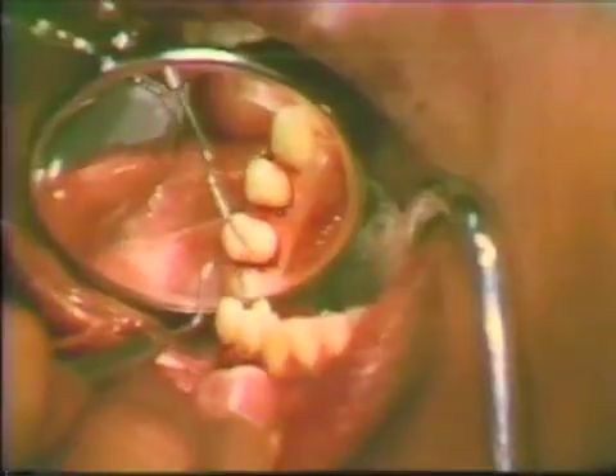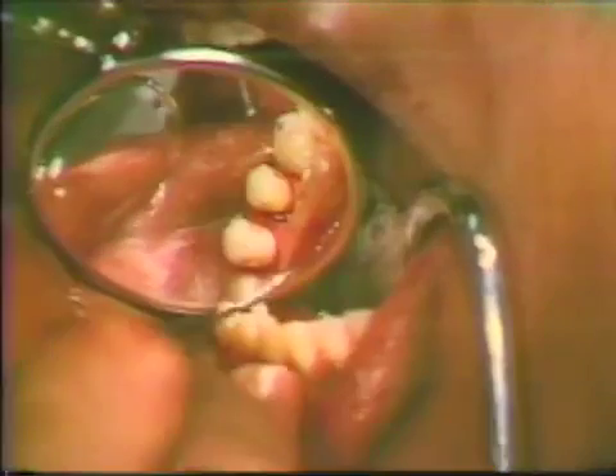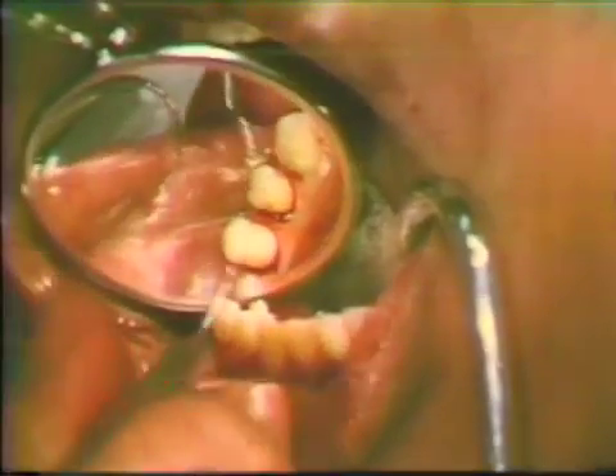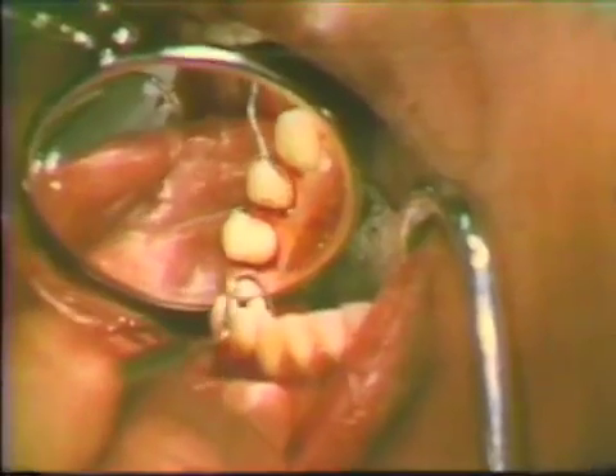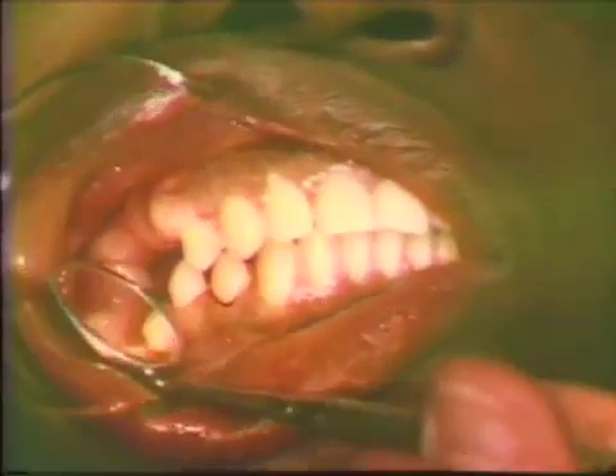If appropriate clasp contours on the buccal cervical of the primary abutment tooth are absent, complete crown coverage rather than three-quarter crown coverage would be indicated. The amount of tooth reduction is then checked to be sure that adequate room has been allowed for the placement of the gold restoration.